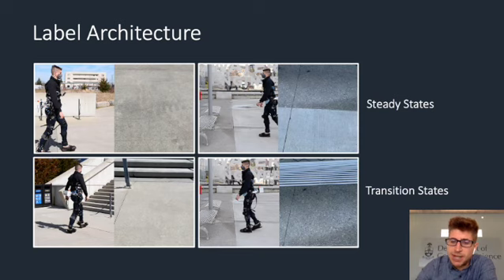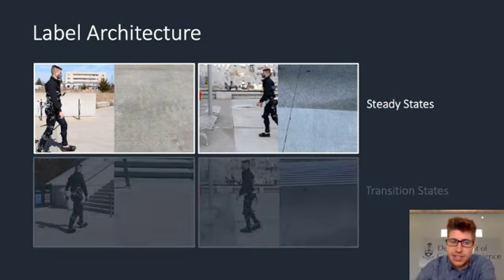So here are some examples of both steady and transition states. The images in the top row show me walking with a robotic exoskeleton while wearing our computer vision system. And these are examples of steady states such that the visual field of view shows only continuous level ground terrain. And these visual fields of view are essentially what the exoskeleton sees.